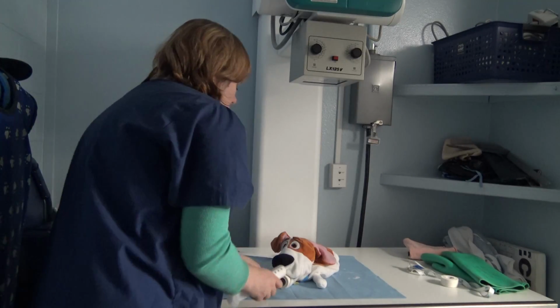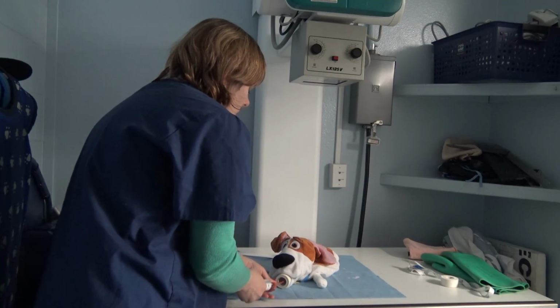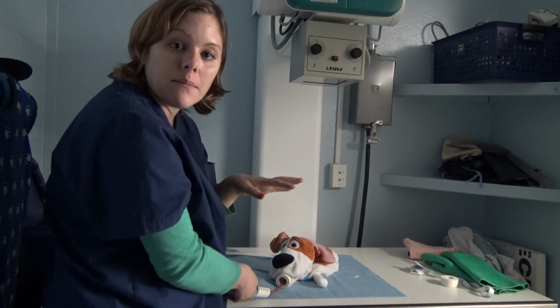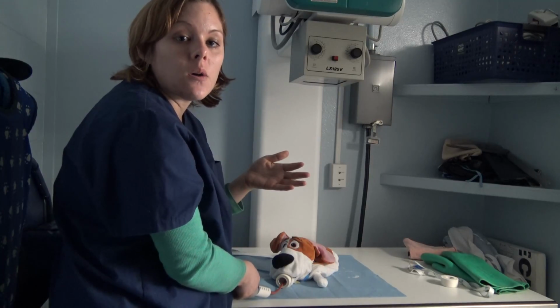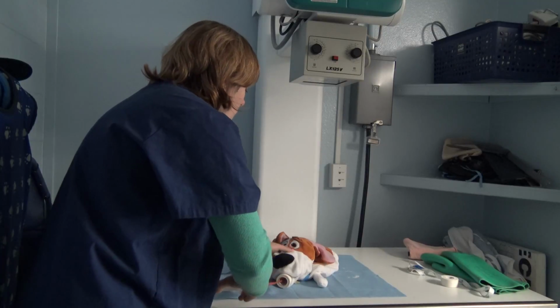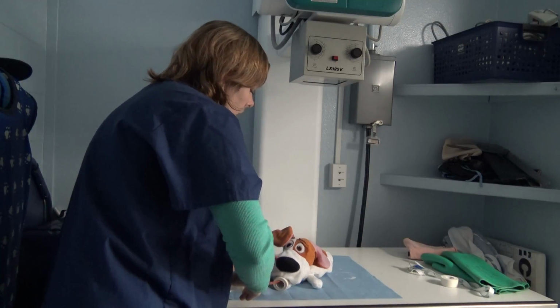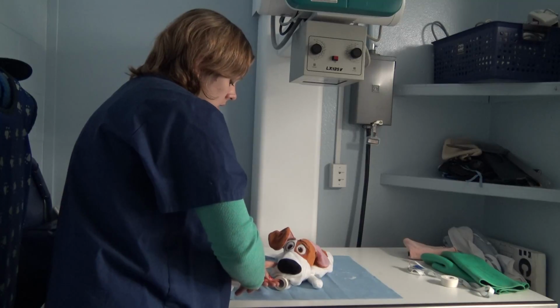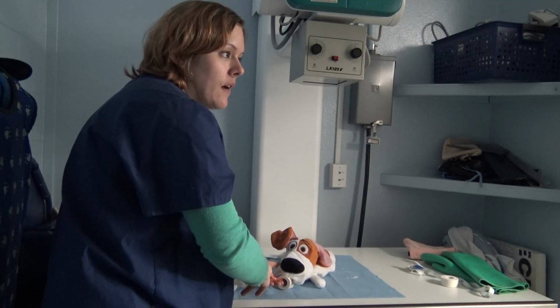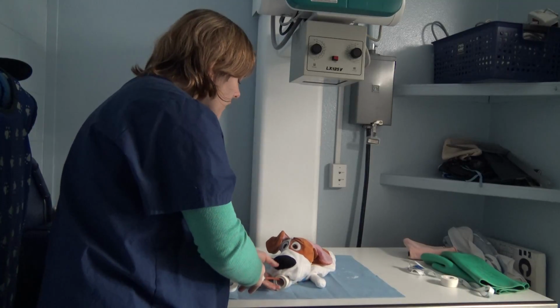So now we're going to enter our barium, and again we had calculated for our size patient, which is about 15 pounds, we're going to do 8 to 10 mils barium per kilogram. So we're going to go ahead and inject this slowly into our patient. And you want to go slowly. It kind of gives them the feel of them swallowing when you're injecting.